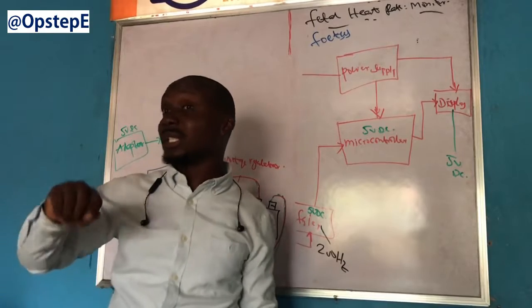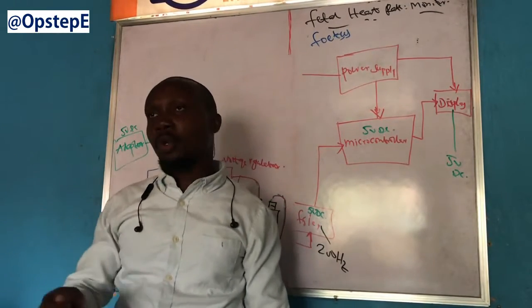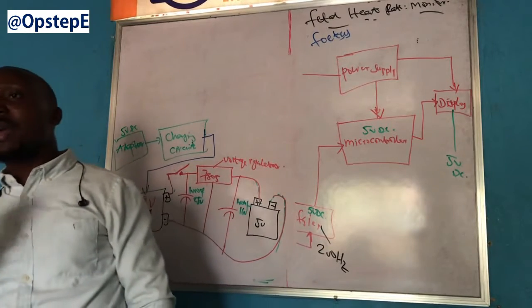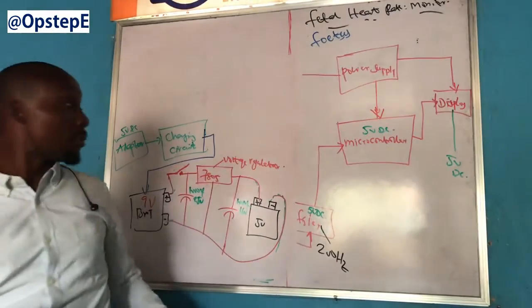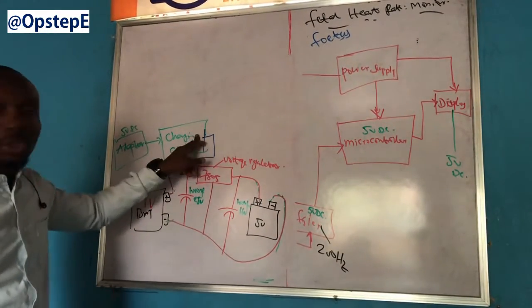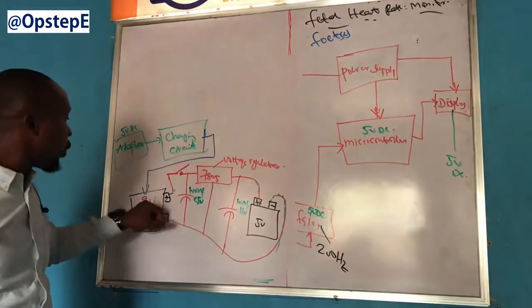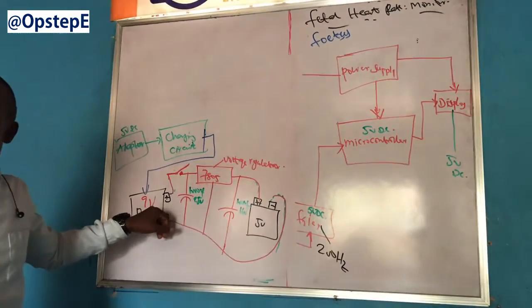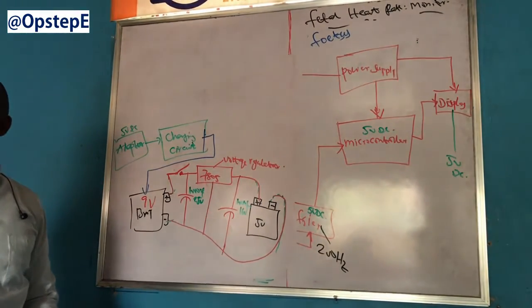That is why at the end of the day, there's a likelihood that we are going to yank off that adapter, because the adapter can only take between 5 volts to 8 volts. The charging circuit can take between 5 volts to 8 volts. If it was taking 8 volts, or if 8 volts was what we fed inside it, it would have been easy for it to quickly charge that battery, because that battery is actually above 5 volts. That battery is 8 point something volts.